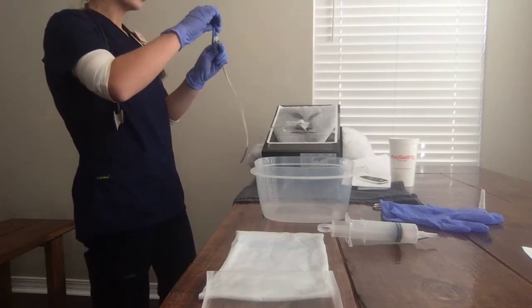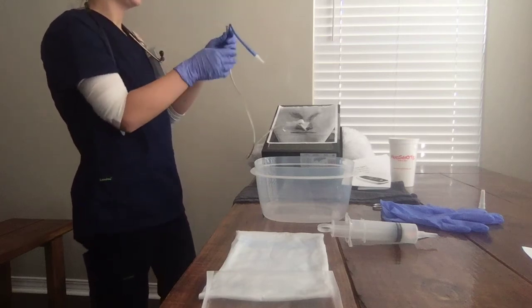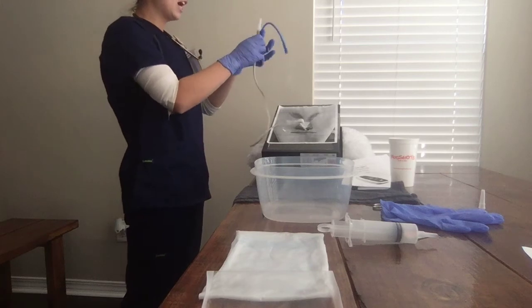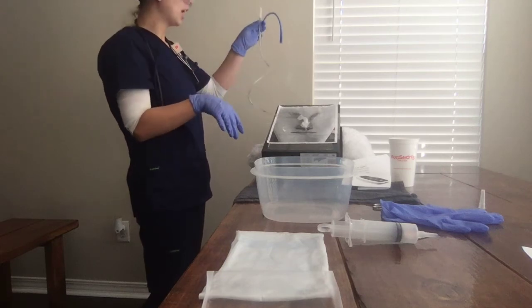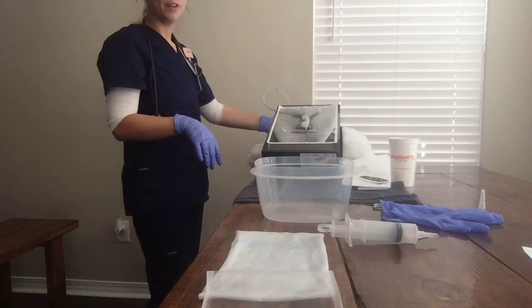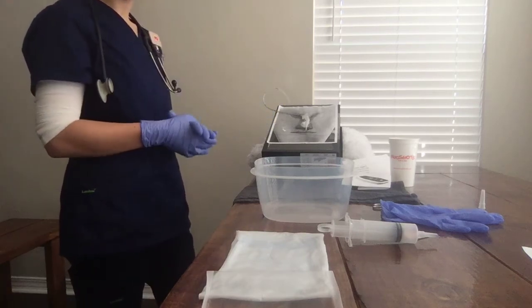And so you cap this when it is not in use, but since we are going to hook it to the intermittent suction, I would uncap and hook it up to the intermittent suction. And you always want the blue pigtail above the stomach, but I do not have a place to place it, so I'm going to place it on the bed. And then I would leave the bed no lower than 30 degrees.